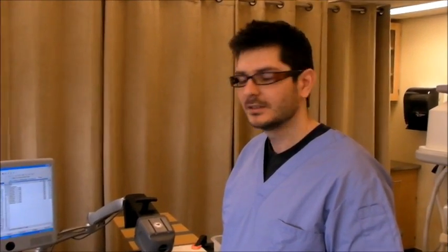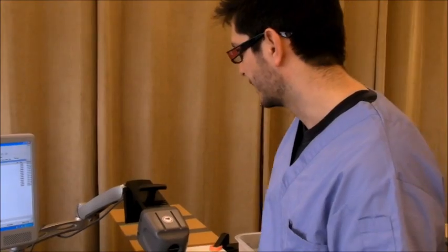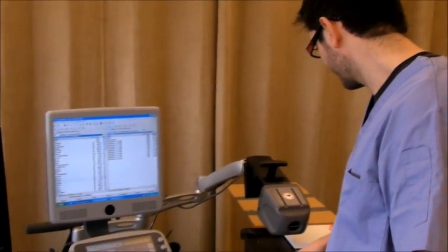In this video I'm going to show you how to calibrate PLUS Toolkit using the fCal application.